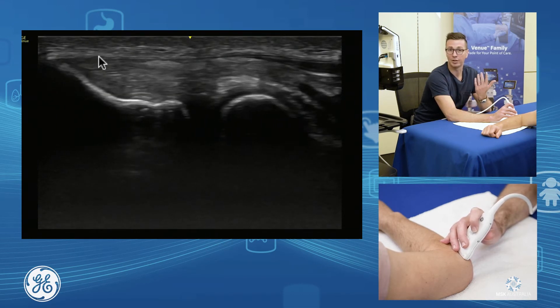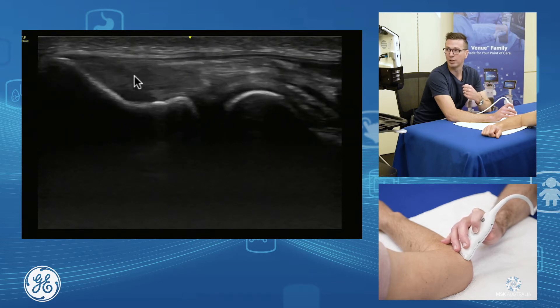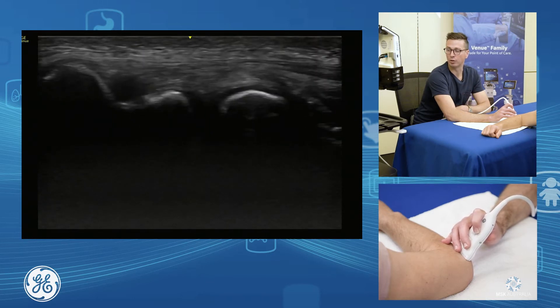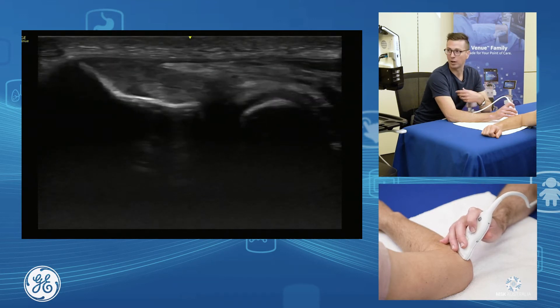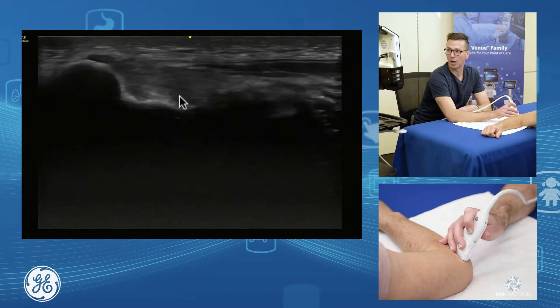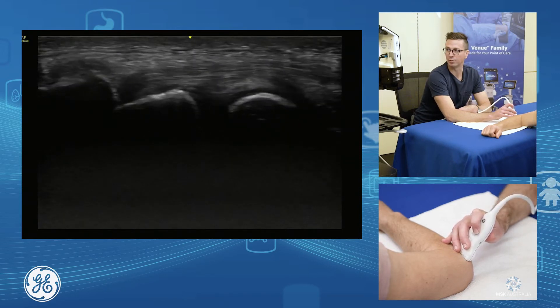The top layer is our extensor digitorum communis, the middle component is extensor carpi radialis brevis, and our deeper component is our radial collateral ligament. It's important to assess all the way through the bulk and have a look at the enthesis footplate — where your tendon is going to fail is at the enthesis. So we assess the enthesis of all components, going up into the main bulk of ECRB and down towards the radial collateral ligament.